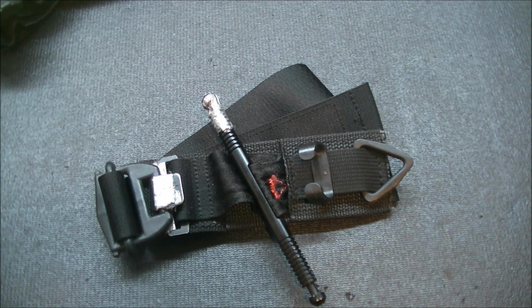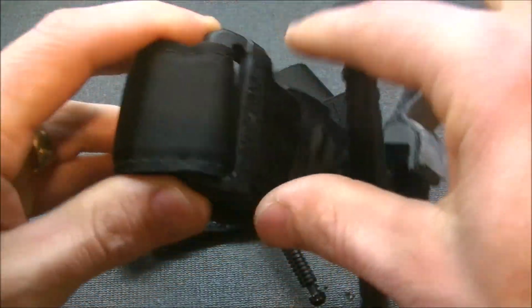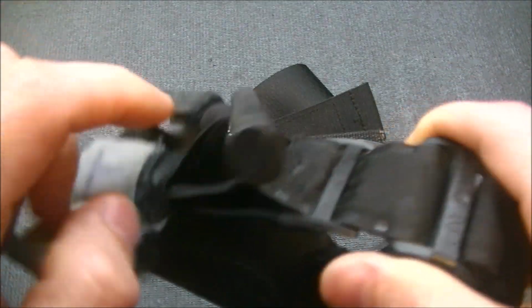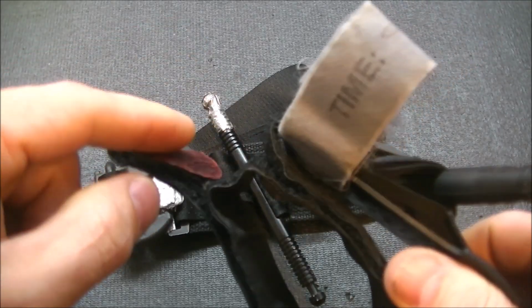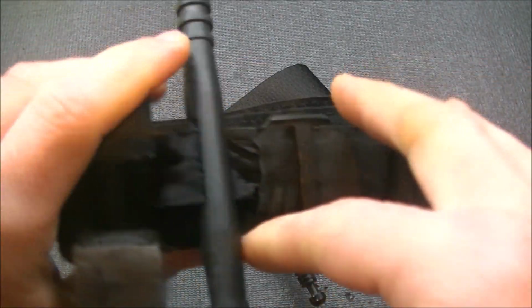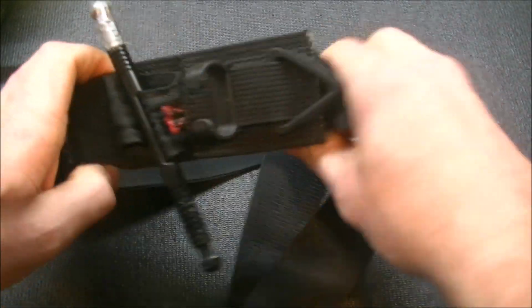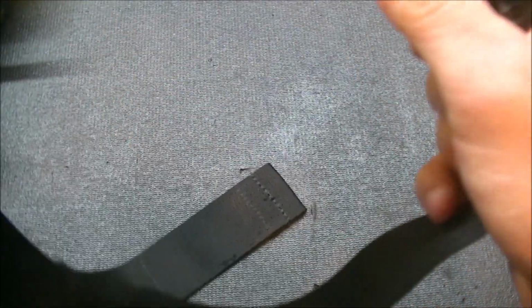So it also resets easy if you're training with them, whereas the cat, you have to actually undo it and take it out of this tri-glide and get this internal band that the windlass is connected to go all the way to the tip and straighten it out and pull them apart and get it as far through as possible so you don't have a bunch of extra slack on this line. This one, it's very easy. You just pull right here. You don't have to do anything fancy for it.